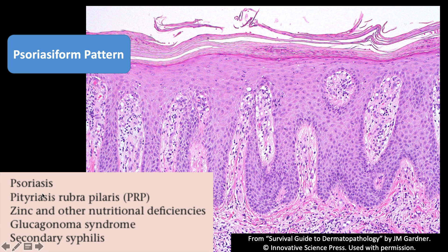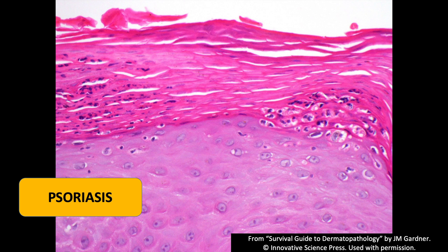Psoriasis is psoriasiform, but there are a variety of other more esoteric things that can be psoriasiform. Syphilis is one that's important to know about, because there is an increasing incidence of syphilis in recent years. So if you see long rete ridges like this with a band of lymphocytes and plasma cells underneath, do a spirochete immunostain to make sure it's not secondary syphilis.